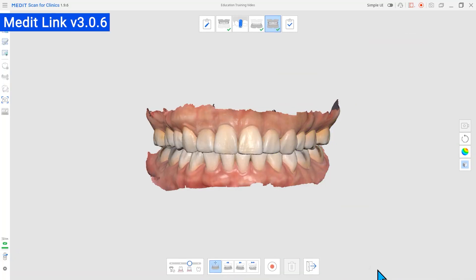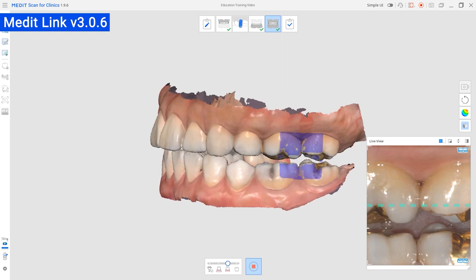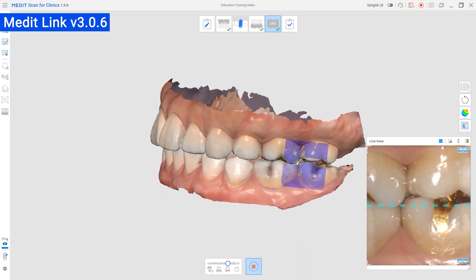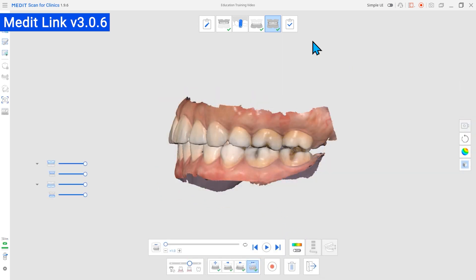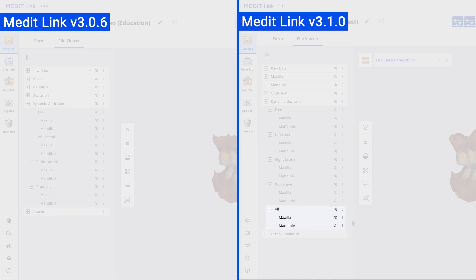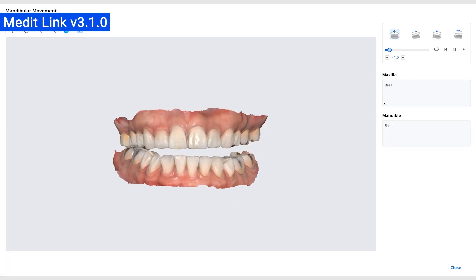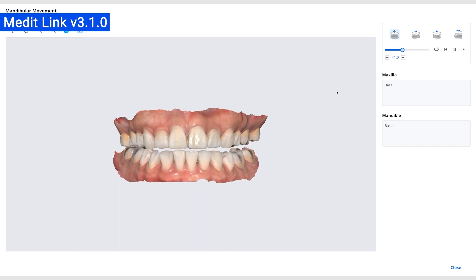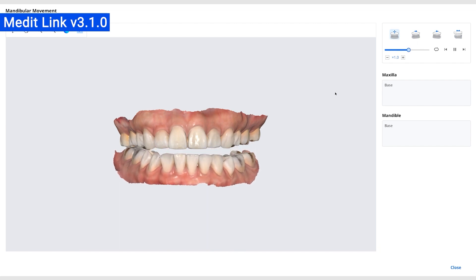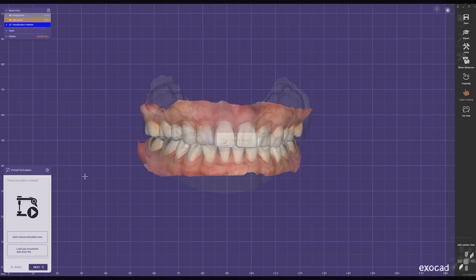And lastly, there is a small but important change to our dynamic occlusion data. Now, an additional single result file that combines recordings of all mandibular movement directions will be created. You can use this single file as the antagonist data when designing restorations, or import it into ExoCAD to replay the movement.